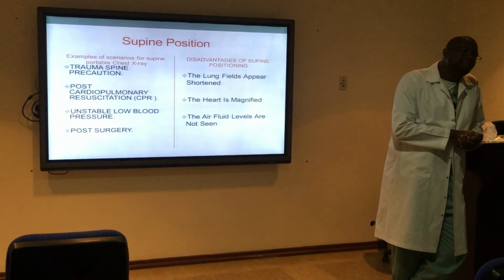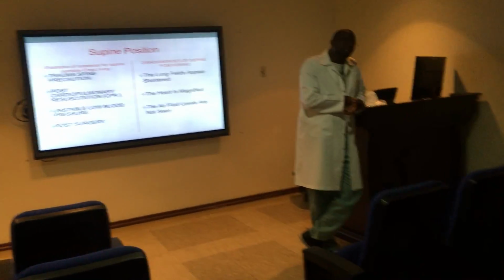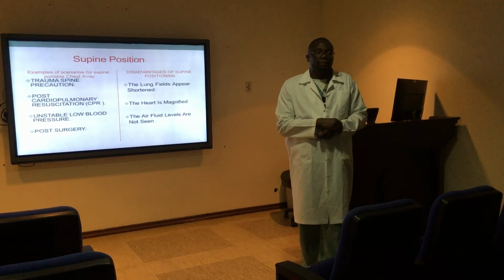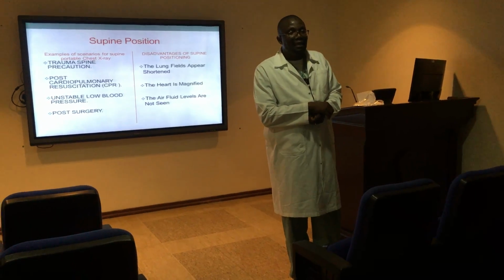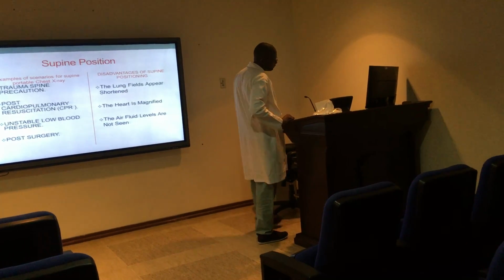There must be a reason the exam has to be done in the supine position. If there is no reason, no indication, try as much as possible to obtain your portable chest X-ray in a semi-erect or sitting position.